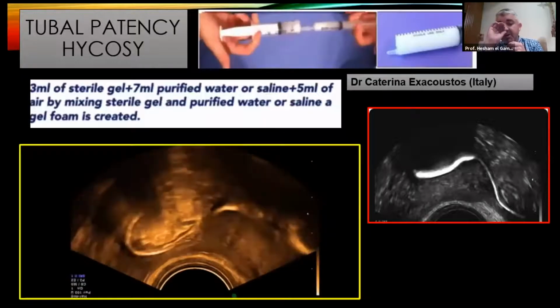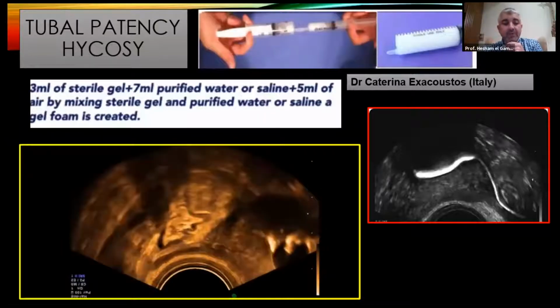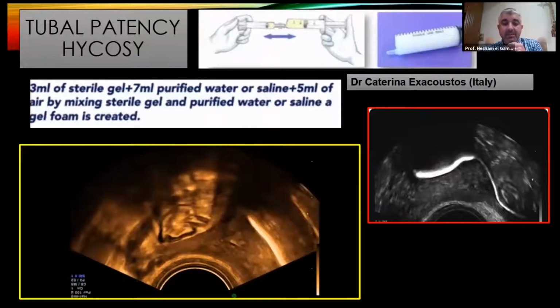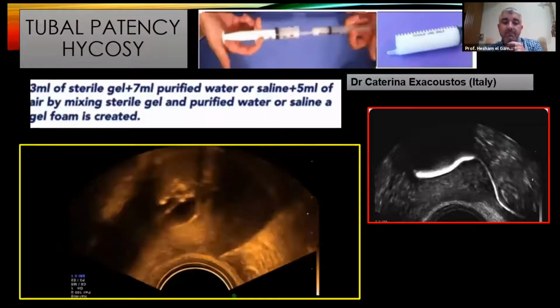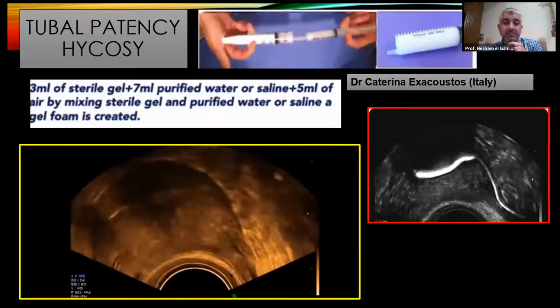And there has been a talk about, or there has been studies about, utilizing 3D with HyCoSy and 3D with HyFoSy, which is the foam. And again, the results are very promising, and people who have very good technique doing it could have very high sensitivity and specificity as regards tubal patency.